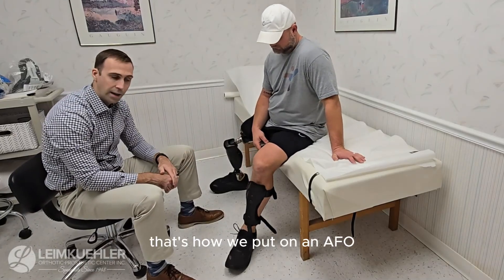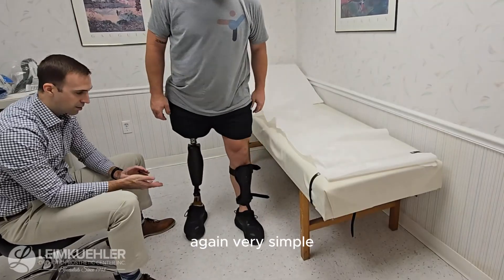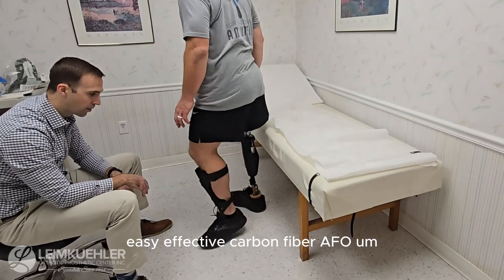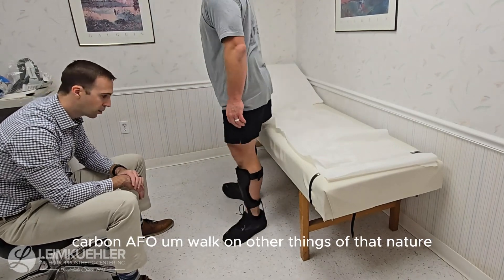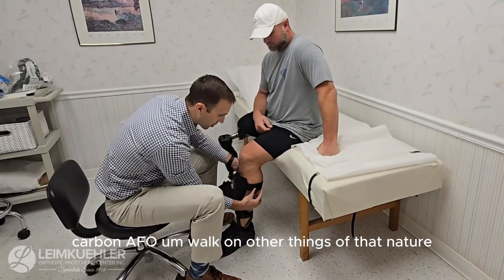That's how we put on an AFO — very simple, easy, effective carbon fiber AFO. You'll usually hear people call this an anterior carbon AFO, a walk-on, or other things of that nature.